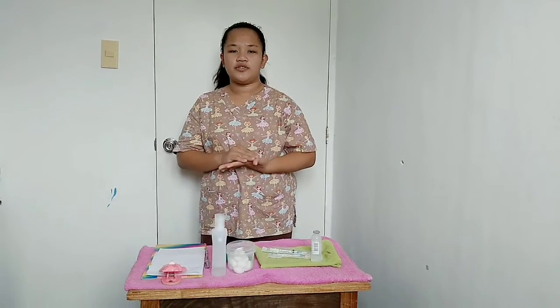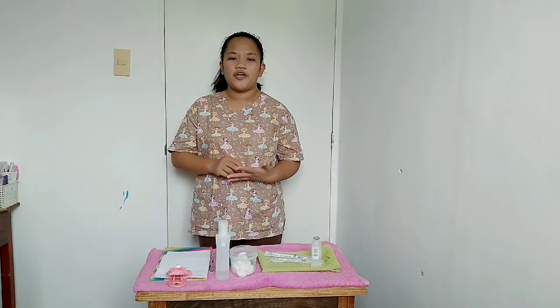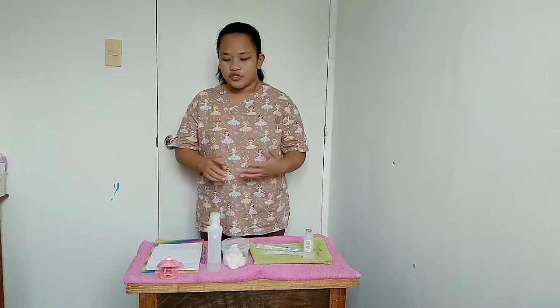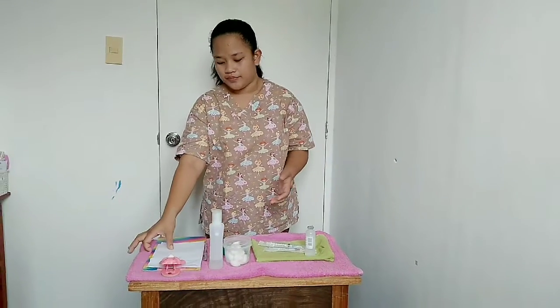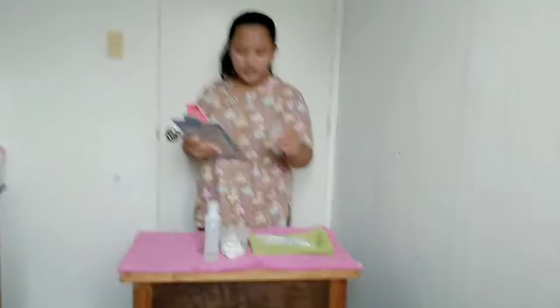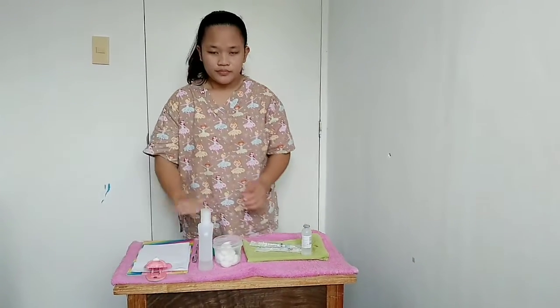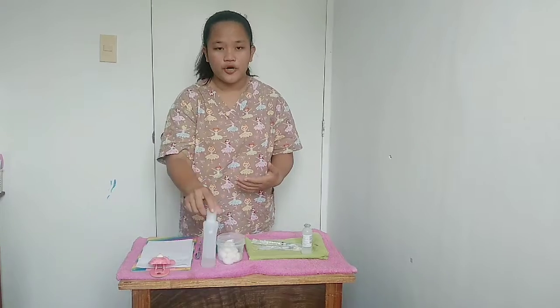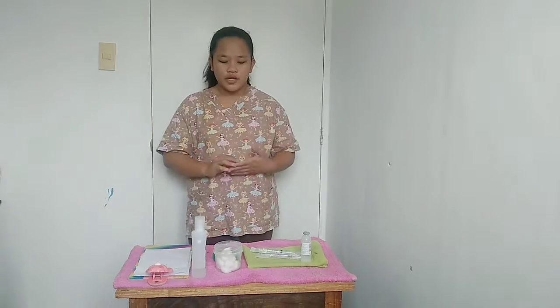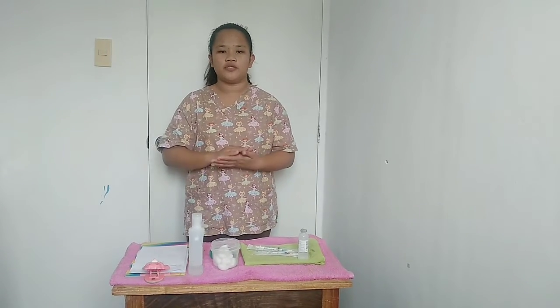And the next procedure is subcutaneous injection. Prior to the conduct of the procedure, first you have to check the doctor's order and then compare the medication. So it is the same. Then we are going to perform hand hygiene. Then we are going to prepare all the equipment needed for the subcutaneous injection.